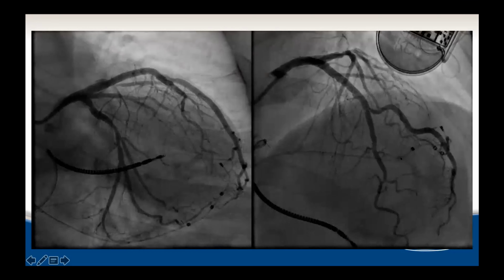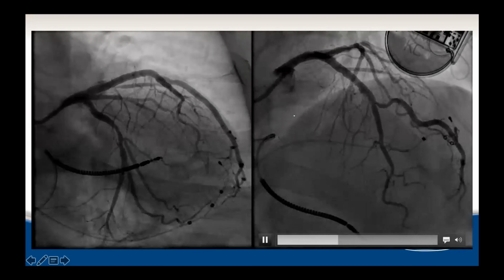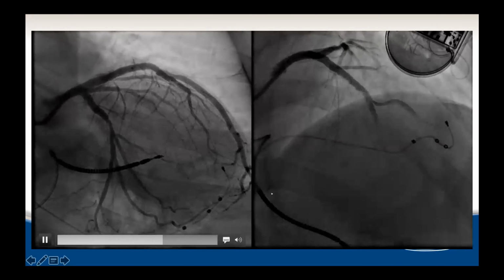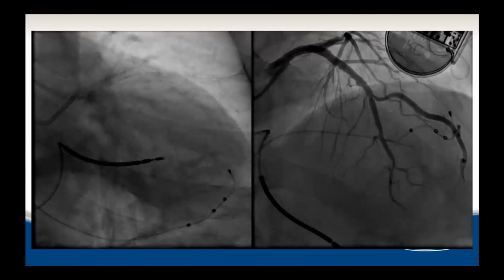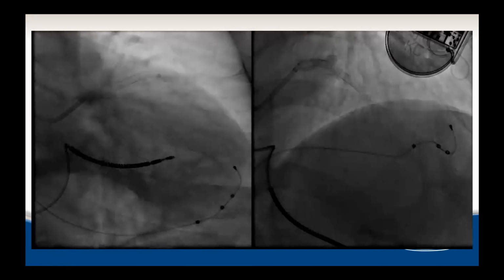Yeah, no, agreed. I mean, we certainly have all pushed it further just to have a perforation and have to deal with that too. So it's always a balance, but I think using it all the time and having that feedback, but obviously, for both imaging and your angio, this is a fantastic result. And it's really a good testament to how, doing atherectomy, you still have to check that we're going to have good expansion.